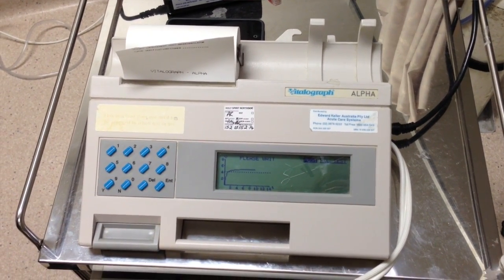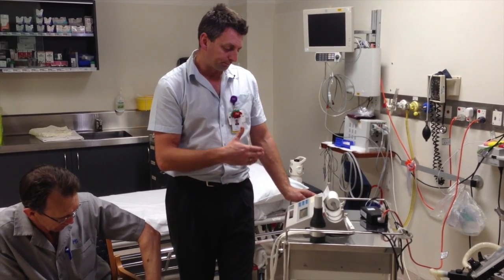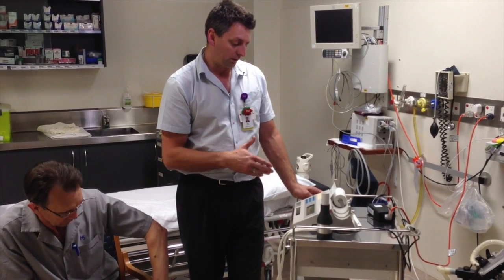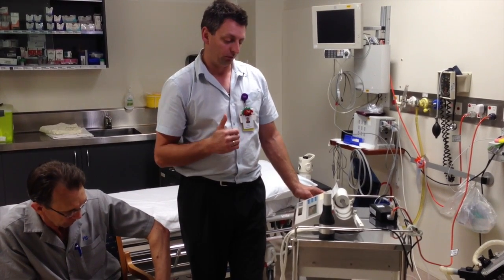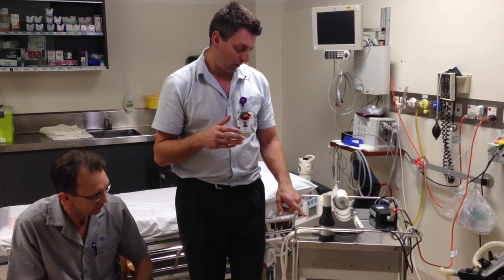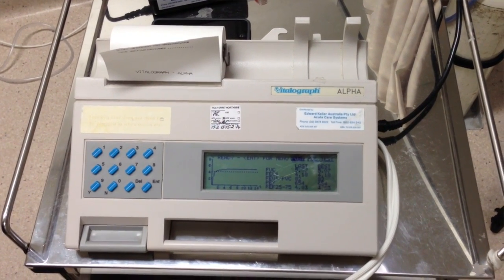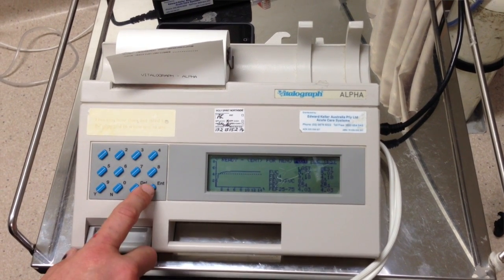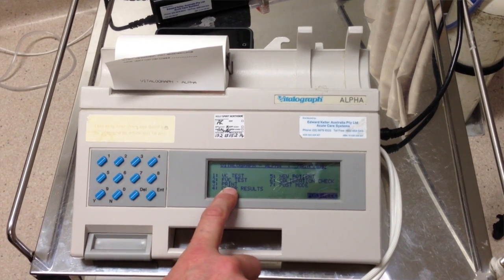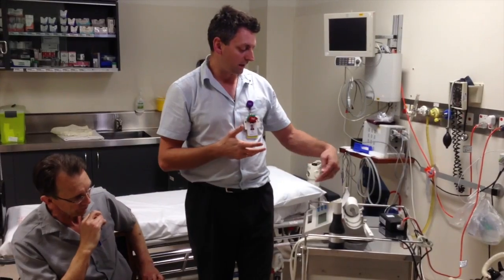We'll see if that nebulizer worked on Derek — hopefully better. We'll wait now for the results to come through after the test is finished and then we can print them out and send them off. The results are coming through now and we've got a good result. Press enter for menu, then press number three to print — that's the secret. Press number three and it will print out the before and after data, then you can tear that off and show the doctor.